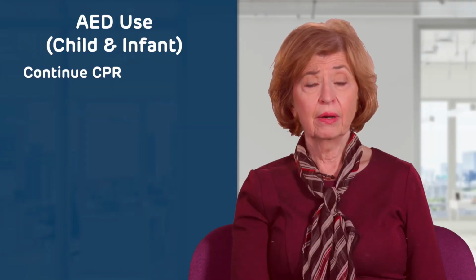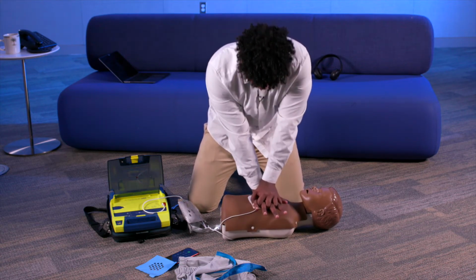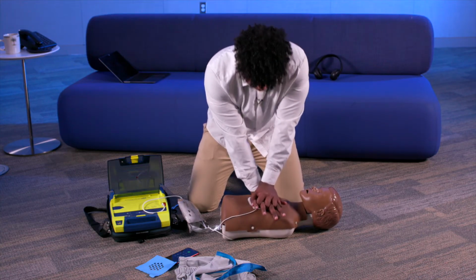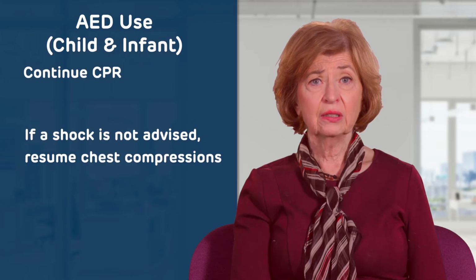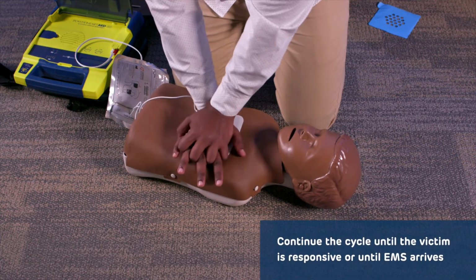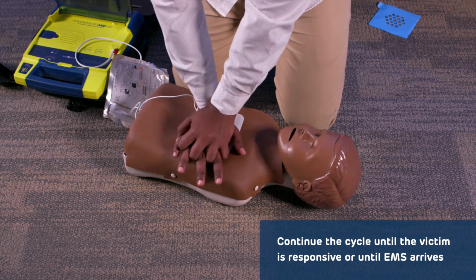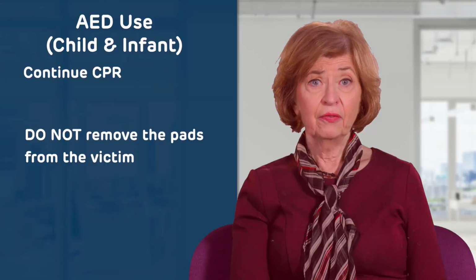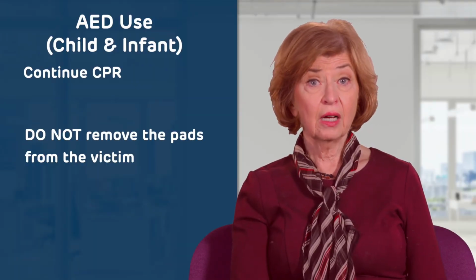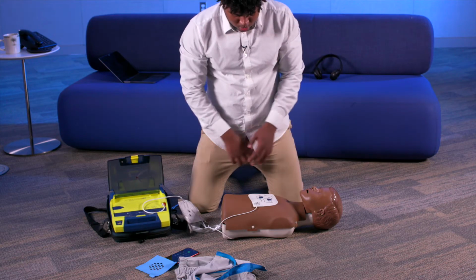Continue CPR. After a shock is delivered, resume CPR until the unit analyzes again. If a shock is not advised, resume compressions. Continue this cycle until the victim is responsive or until EMS arrives. If the victim wakes up, do not remove the pads from their chest. It is not uncommon for them to experience another arrest and need another shock.